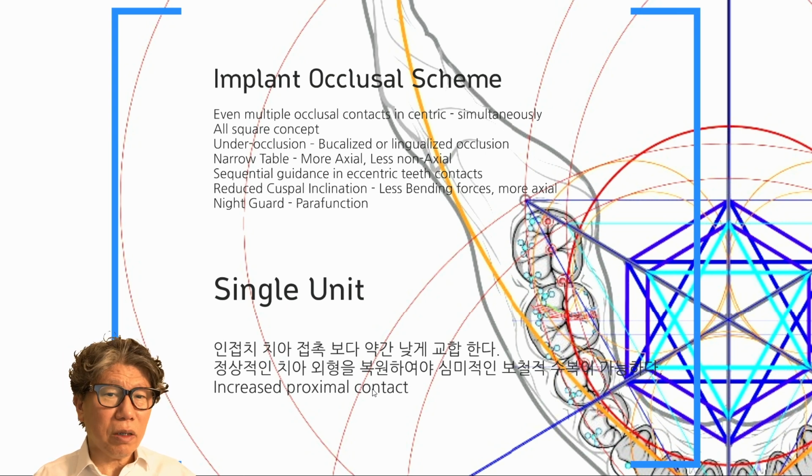As I recall, I used a 3i implant, and if I think a little more about such cases, having the proximal contact surface between the first molar in the front and the second molar implant prosthesis that I applied the implant to may reduce loosening. However, since there is no choice but for the overload to be relieved, that was a bit disappointing for me.